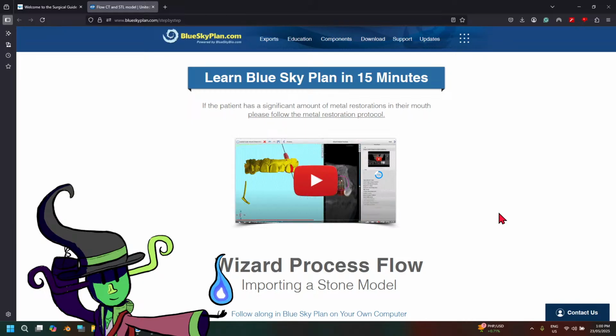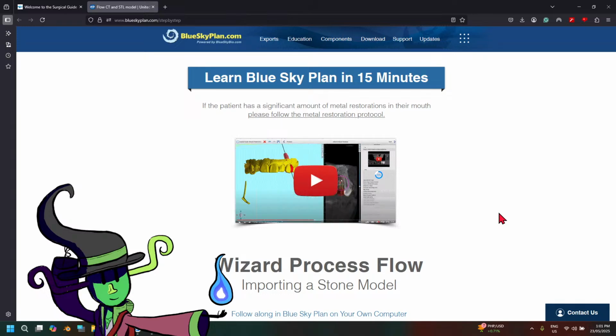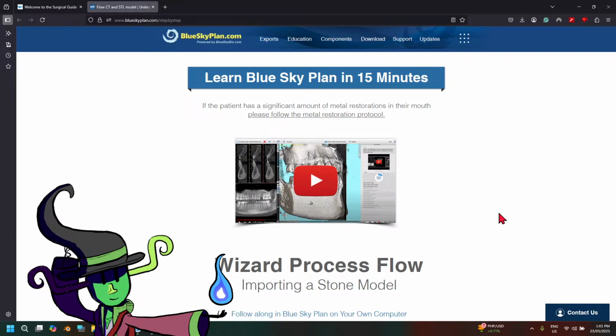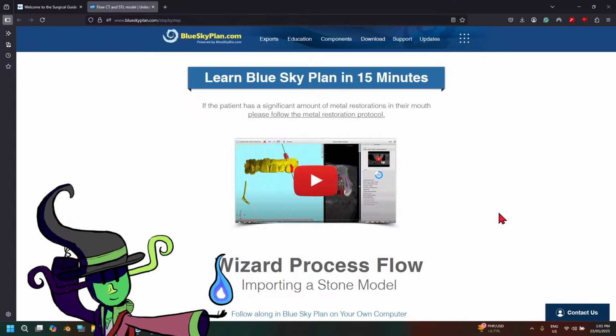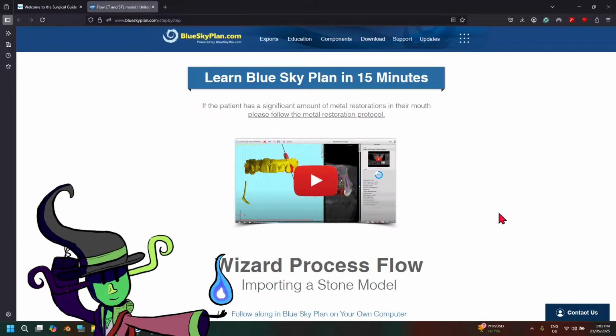I technically do have the program in my computer, but the problem is that I haven't updated it ever since. And if I'm gonna be showing you guys some dental CAD software, I might as well show you guys something that's more accessible to everyone here.